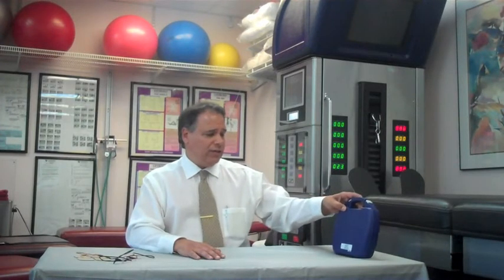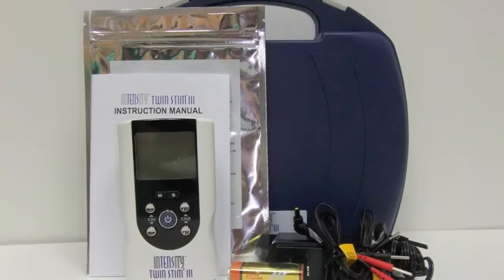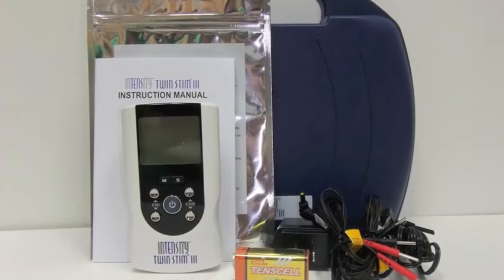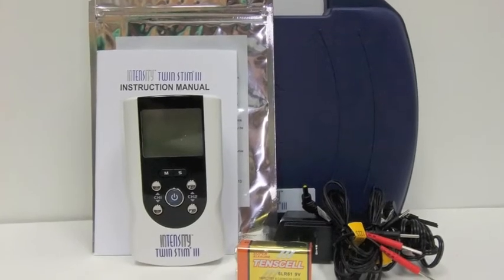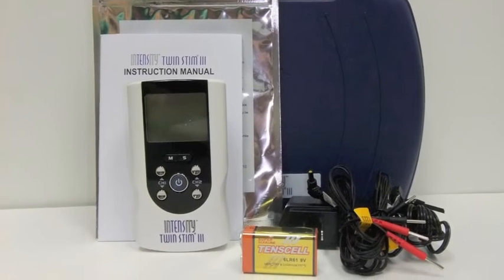Today we're going to discuss the Intensity Twin Stim 3, which is a combination device that has four TENS modes and three muscle stimulation modes. You'll notice that your device has everything that you need to get started: there's an instruction manual, electrodes, the Twin Stim 3, a battery, an AC adapter, and the lead wires.